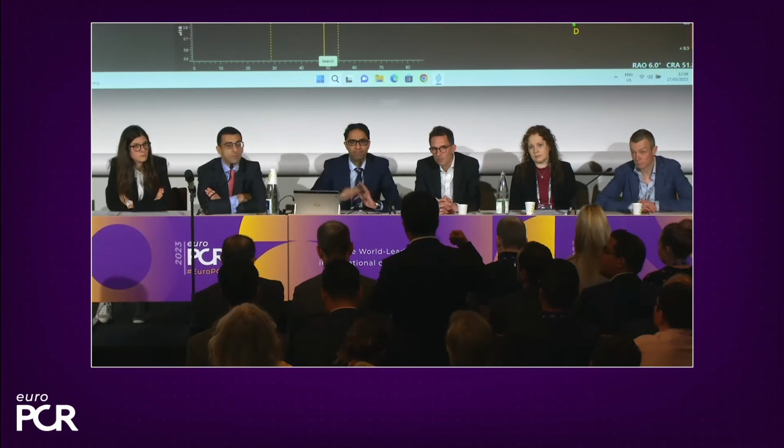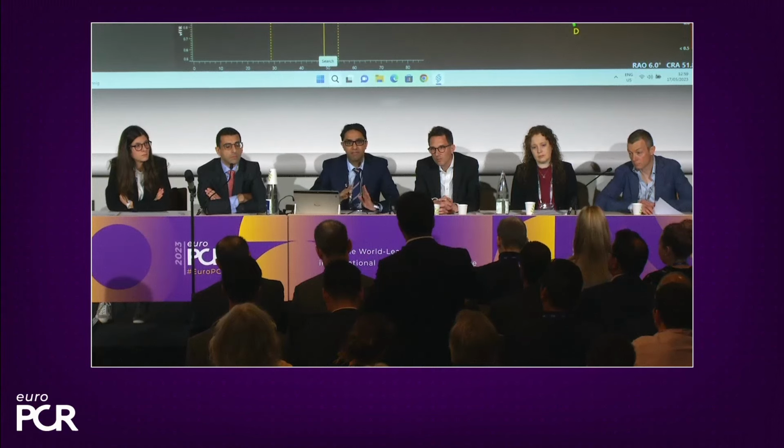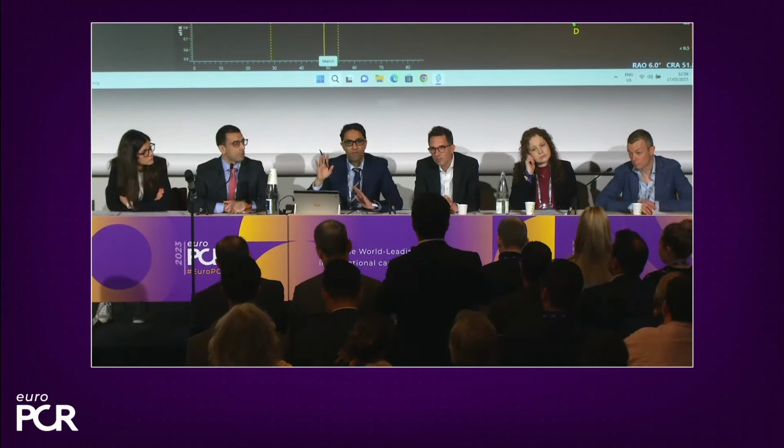That's it. Okay. But we look at the pressure drop calculation. Is the pressure input not enough? We need the flow information, I guess. No. This is a validated technique in multiple studies with very high diagnostic accuracy based only on the blood pressure and the two angiograms. Okay. Thank you.